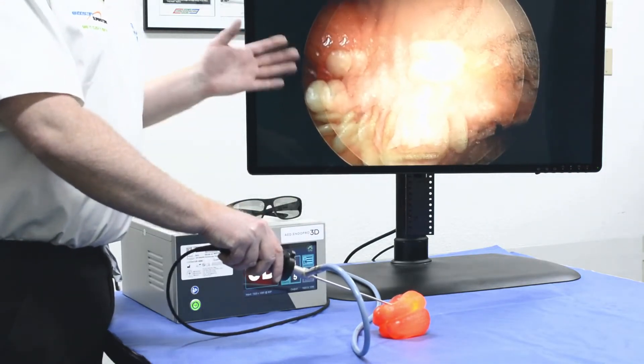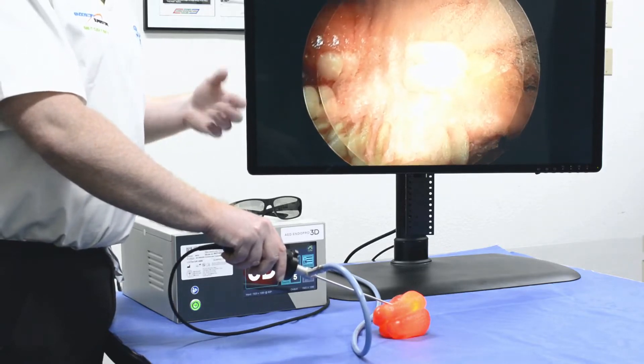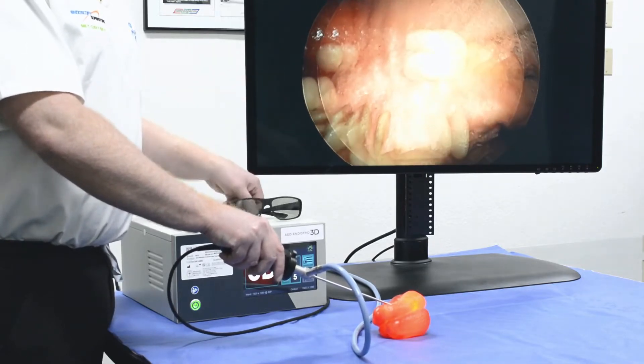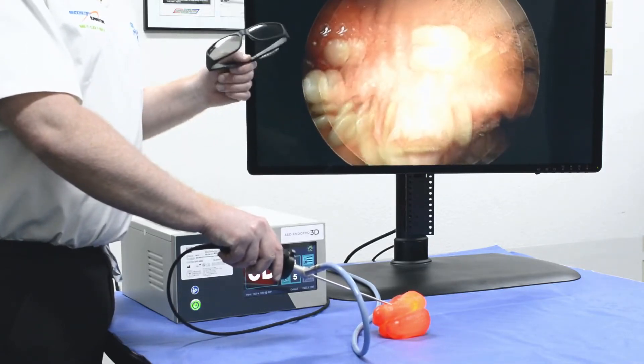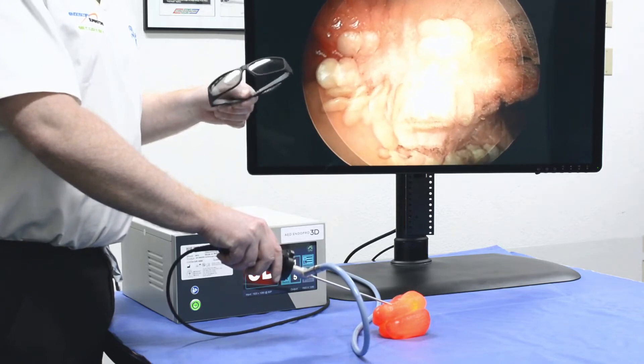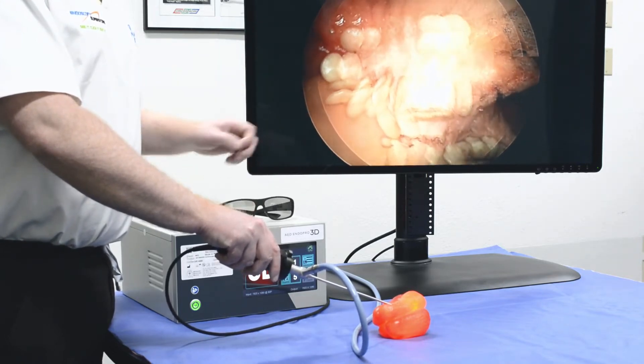Now this image we're not able to share with you in true 3D based on limitations of our camera, but it's viewable in real time with 3D glasses that would just fit over existing eyewear.